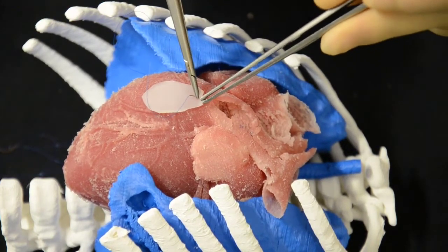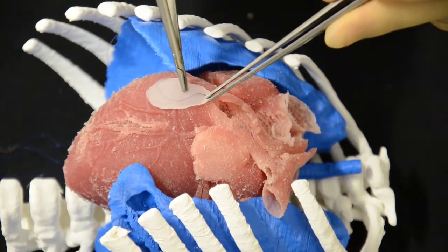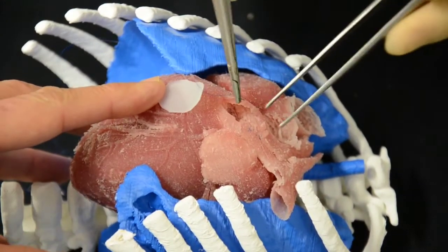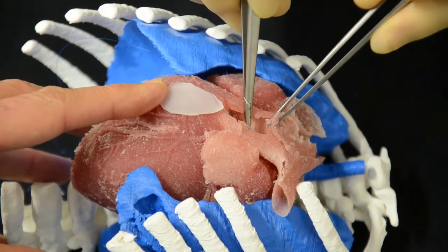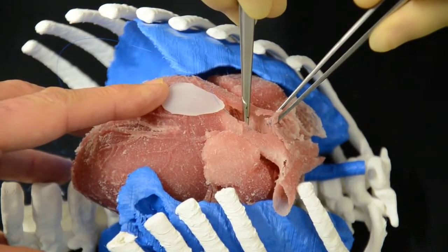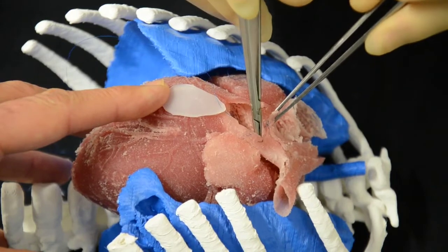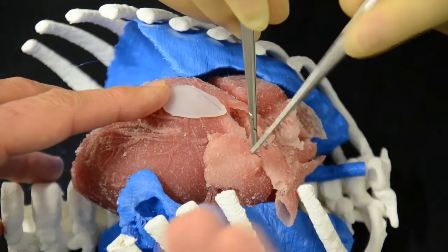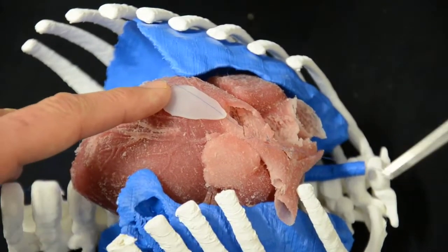So he's going now through the patch — I'm just going to hold it with my hands. When he's going through the corner, in this material you probably need to go away from the edge.